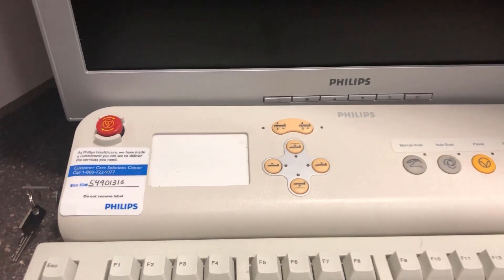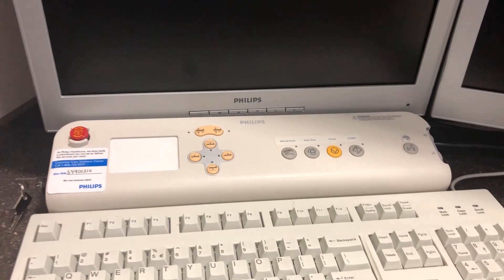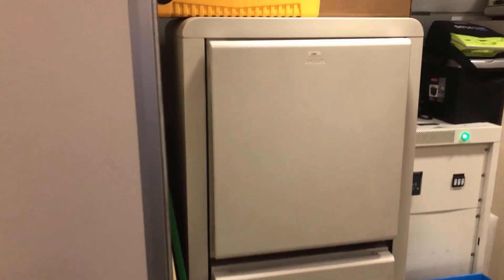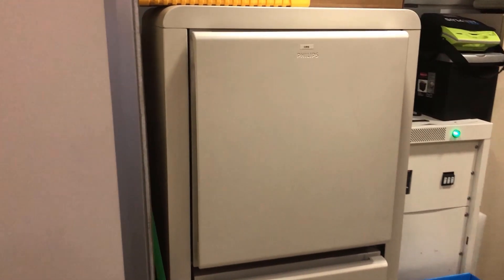Okay, the gantry is completely powered off. Okay, next we're going to find the CIRS server rack, looks like this.